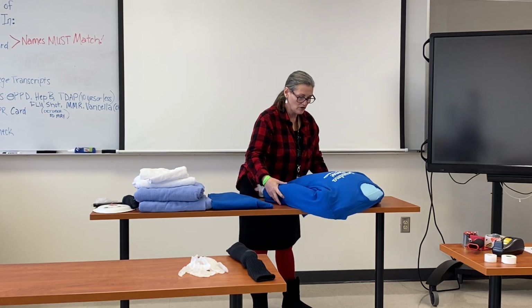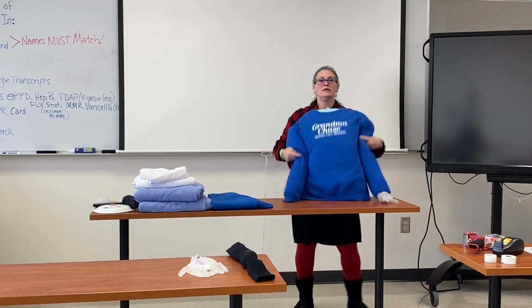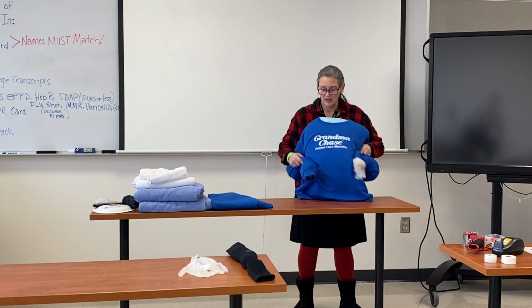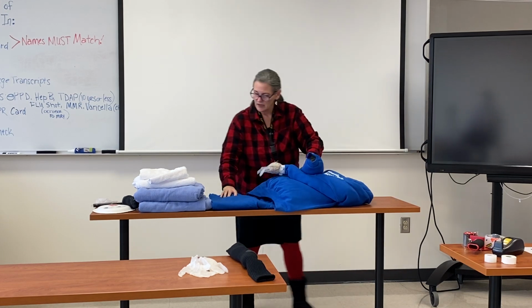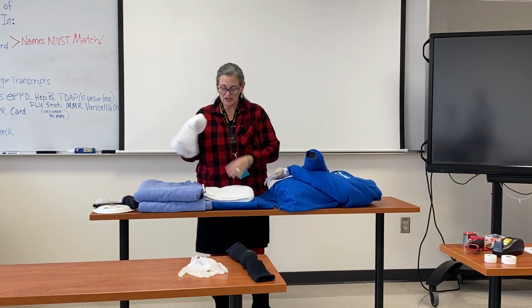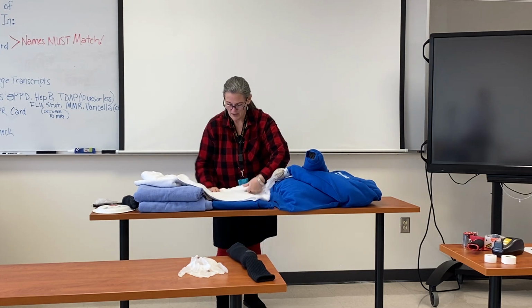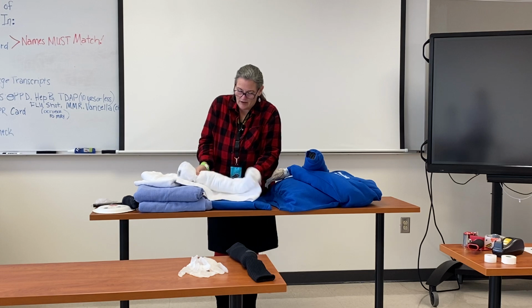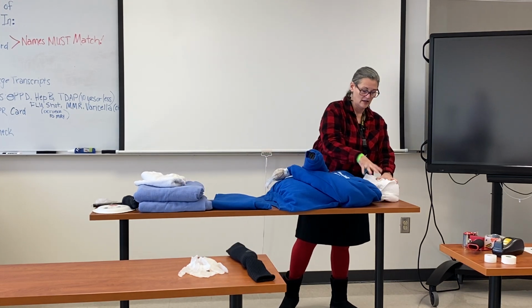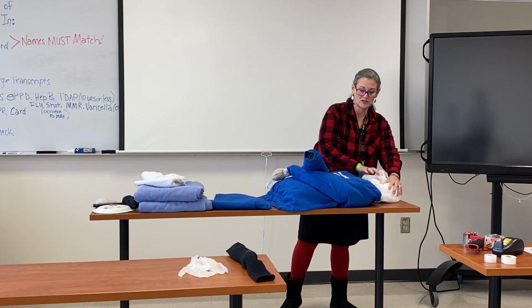Okay, so now Granny has an upper torso. Granny has now got two arms and a body. So if you had a hoodie sweatshirt, you could take another towel and roll it up and then put it into a circle like this and put it in the hood, and that would make you a head. Okay? So there Granny has a head to work on.